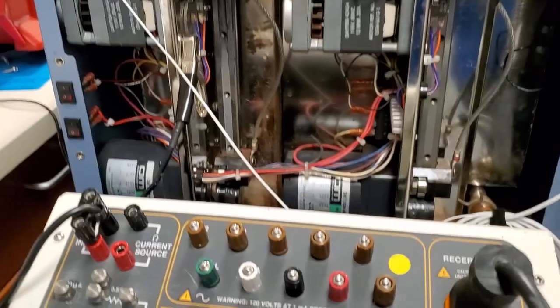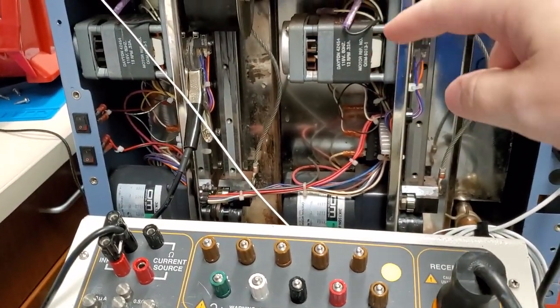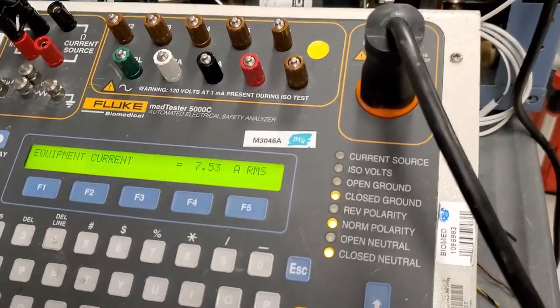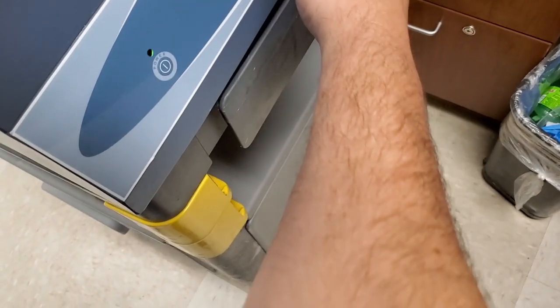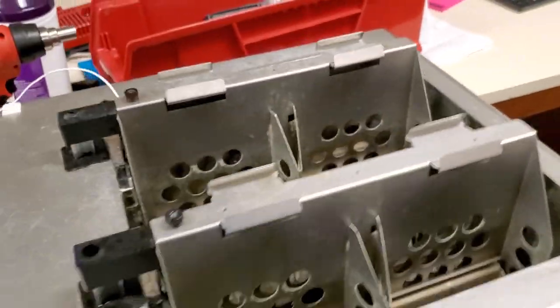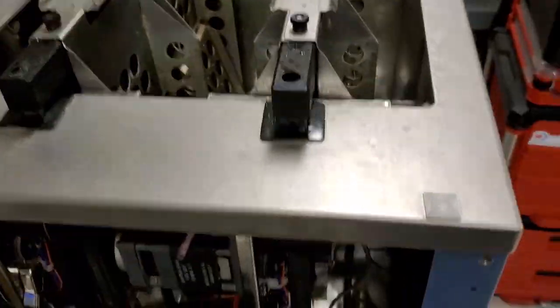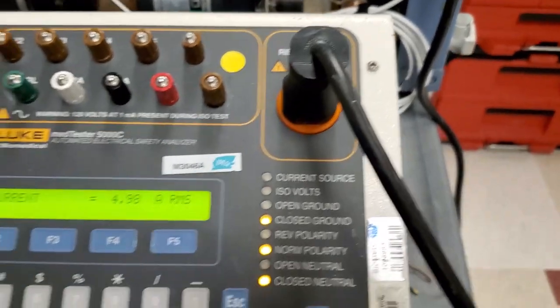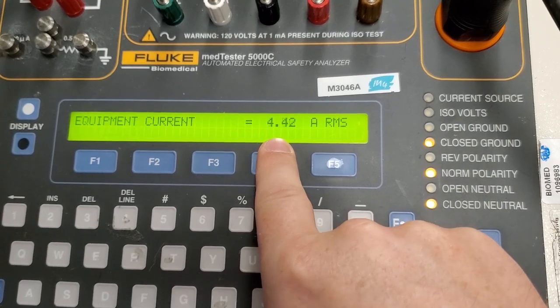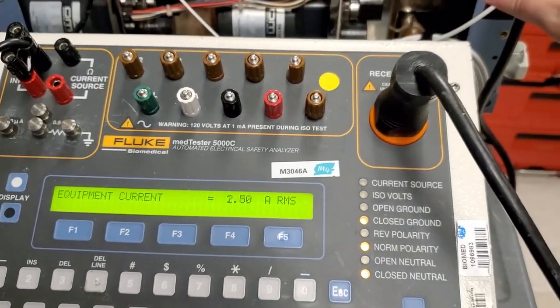We can go ahead and turn on the agitators and the lift motors because we've got to test everything and see how much current this device is really drawing under max load. Here's the agitators running and the heating element is running. We can monitor the amperage against the data plate for this unit.